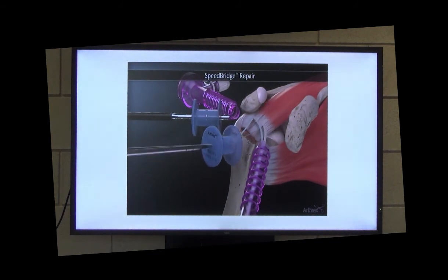Prepare a lateral bone socket. Tension the fiber tapes and then insert the eyelet into the bone socket. Do not attempt to apply tension with the eyelet in the bone socket. If it is determined that the tension is not adequate, the driver can be backed out and tension will be adjusted. Insert the cannulated and vented biocomposite swivel lock anchor.